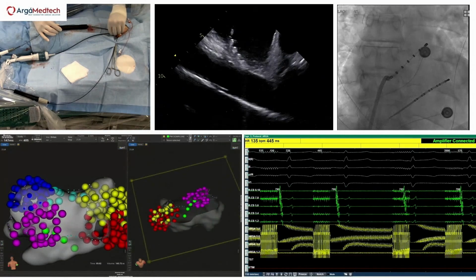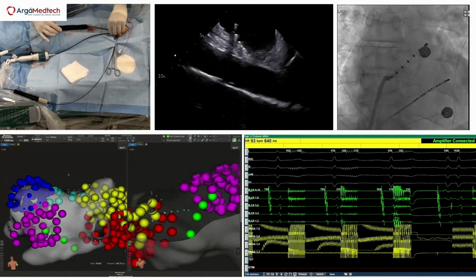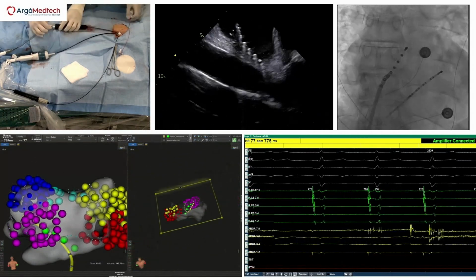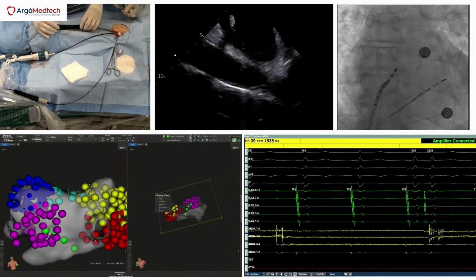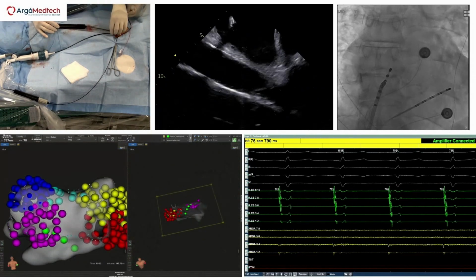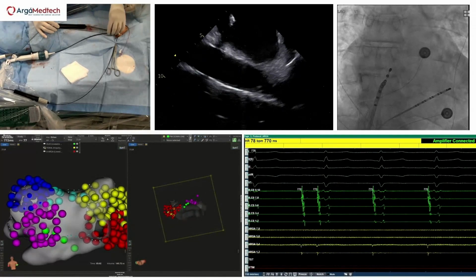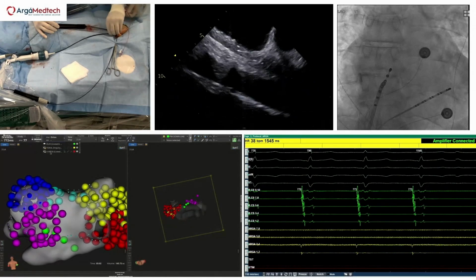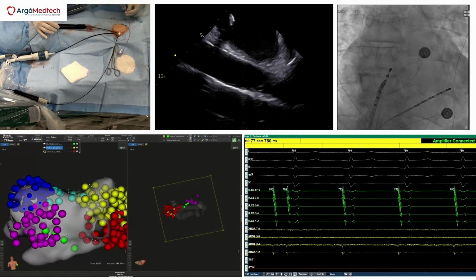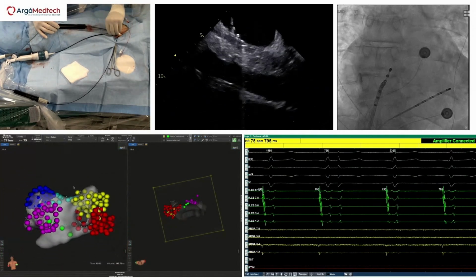And now what I'm going to add, a couple of nitro. Please go nitro. And now I just connect the rest with a focal. Good contact there. Can I visualize the catheter? Focal, Ante? Focal 1, 2. So now we switch to focal ablation. So we're now going to do just bipolar ablation between 1 and 2 electrodes. I need 1, 2 visualization. Antonio?